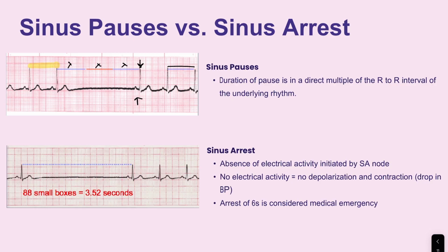So think about it like this: with a sinus pause, you're just taking a little break. You're pausing on the rhythm, but you're going to come back to it. You're going to come back. Or a sinus arrest, you are stopping. You don't really have an intention of getting started again, and you may or may not, depending on the scenario.